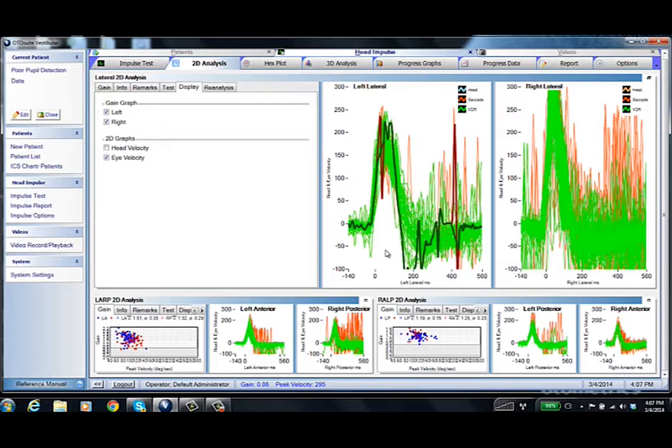Now, one trick you can do if the person does have really big pupils, and Lee McGarvey does this, is you can get a pen light and just shine it so that it constricts the pupil. Some people need that, but not everybody. The other thing then is make sure that they're actually doing a good pupil threshold, or click the auto threshold.